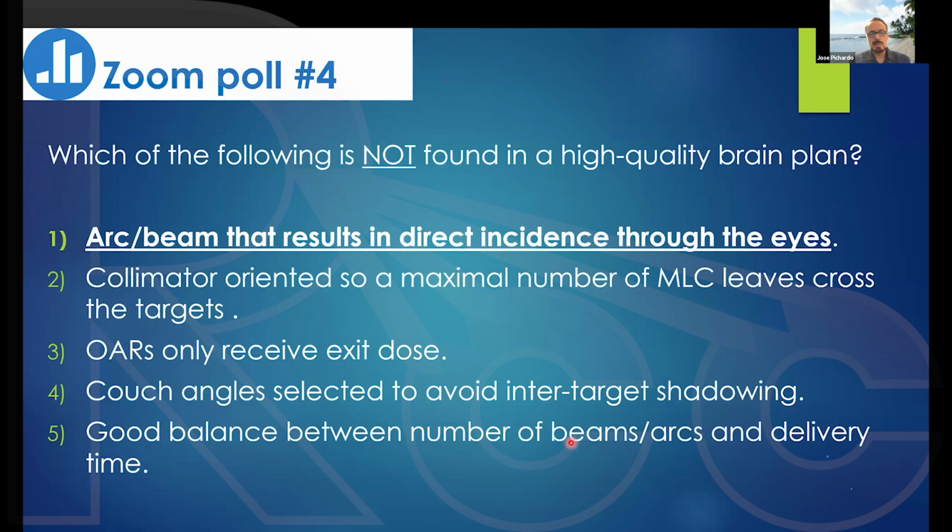Yeah, the robustness has more to do with the latter of what you were saying. It has to do with how accurate your dose actually is, right? So that has to do with modeling. And of course, when you have a high modulation factor, you have a lot of MLC. You will see that if you look at the MLC, there are a lot of apertures that are very, very small. And you know that it's very difficult to measure and calculate output factors for very, very small apertures, right? It's going to be very inaccurate. So the more of those small apertures that you have, the more inaccurate your dose is. Okay, your calculated doses in the plan.